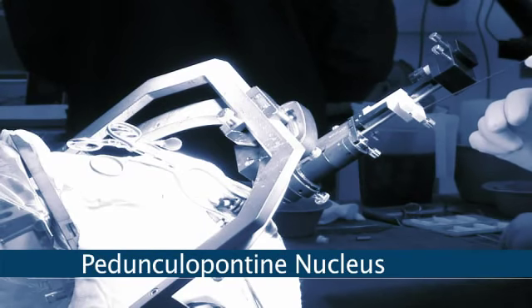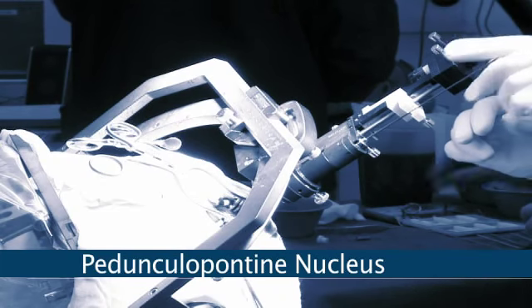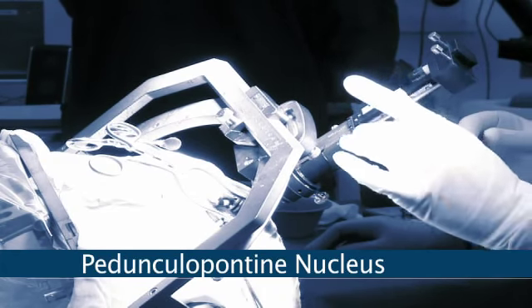Some patients with Parkinson's disease have particular problems with their gait, or their walking. And when they have a lot of gait freezing, that aspect of their condition may not always respond to the more traditional targets. We've used the pedunculopontine nucleus, or PPN, to treat that aspect of their condition, and in some patients that can work. There's not a huge body of evidence yet around the world to show whether that target is going to deliver good long-term benefits, but certainly some patients will derive benefit in that situation.